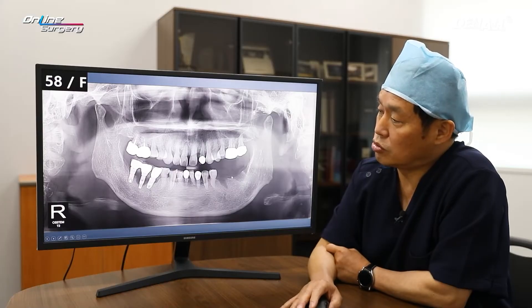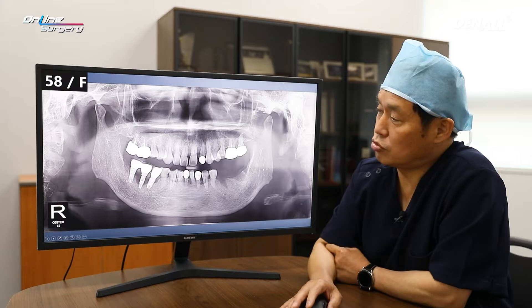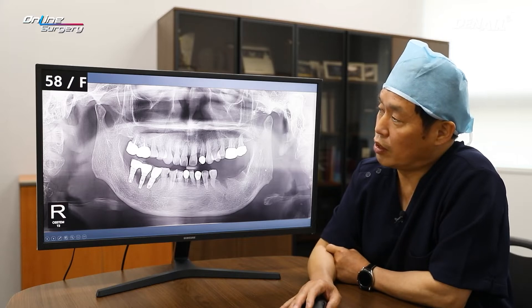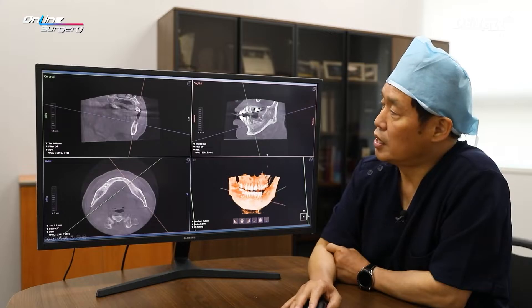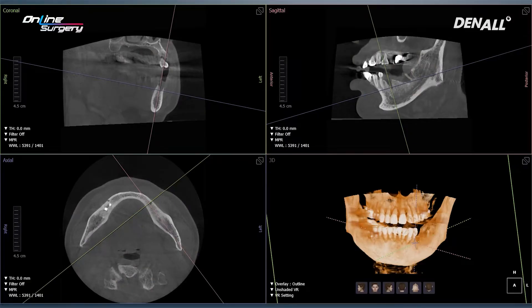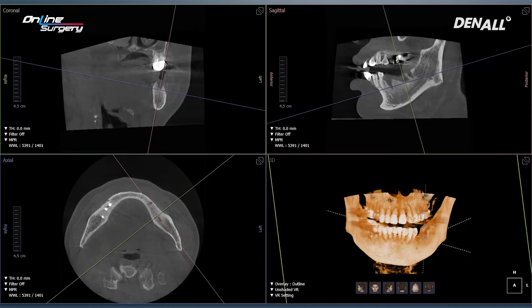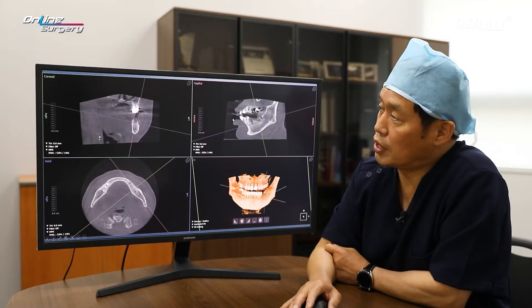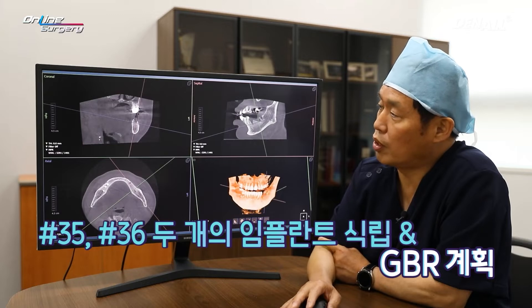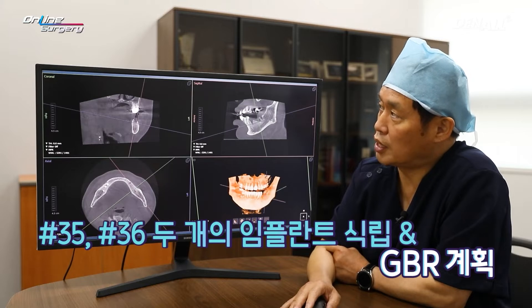The patient wanted surgery, and I planned for one guide surgery. Looking at CT, in the extracted area of number five, the alveolar bone on the buccal side has a lot of resorption. Number six was already missing. Number seven was tilted. In that area, two implants were planned — with distance between number five and six — and GBR was planned in the area with resorbed alveolar bone.